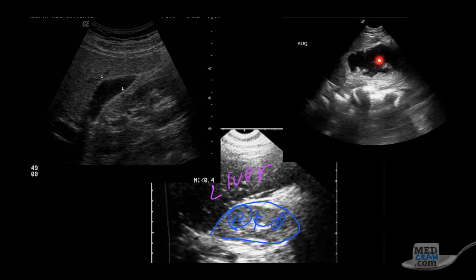The last pitfall is fluid within bowel in the right upper quadrant — this could be the colon at the hepatic flexure. Applying our principles of free fluid: this is not free, as it's within the bowel. You can see the invaginations of the bowel lining and fluid within it. The wall of the bowel is visible — this is fluid within the bowel, not free fluid.